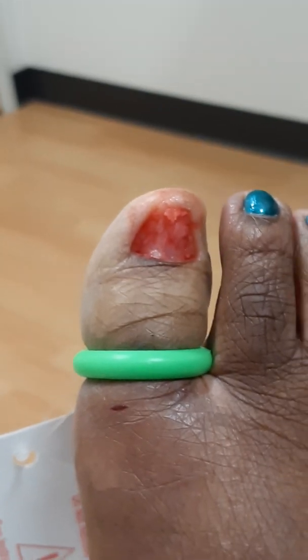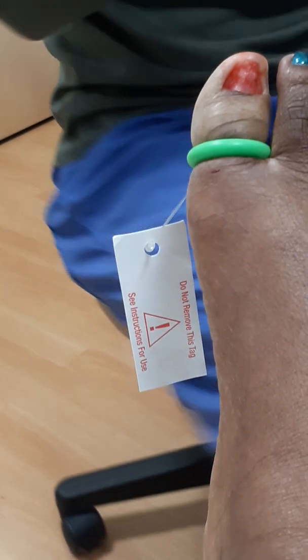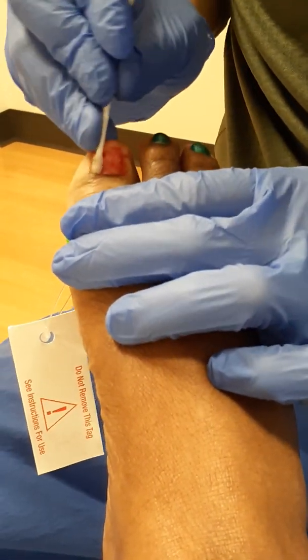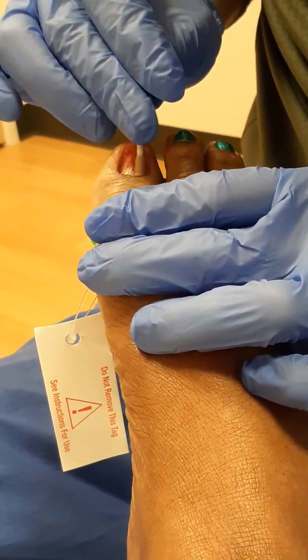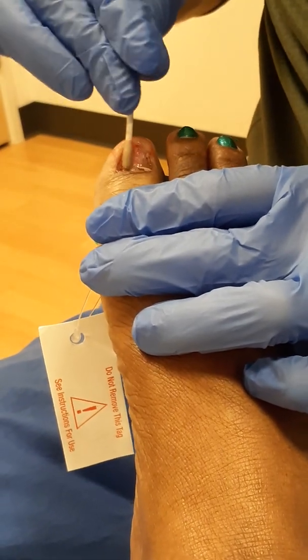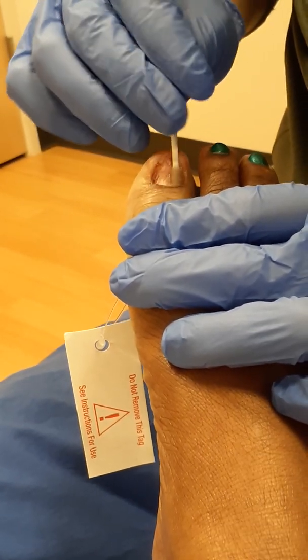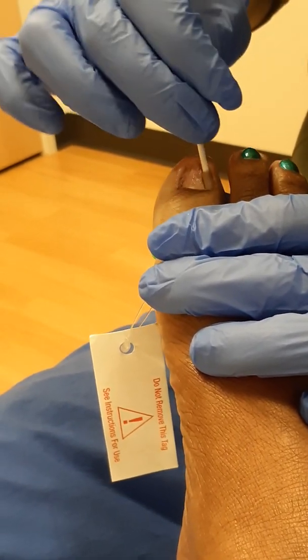I'm going to start with the phenol now. That's the chemical we use to kill everything, okay? So did Dr. Tidwell kind of go over what this does? I guess what he just said, it just kills it, doesn't make it grow back and stuff like that. Right, so it's a chemical, you're basically chemically burning the nail bed, okay? So you're going to notice some kind of drainage and redness to this toe for a little while, because we're essentially burning it, okay? So think about how when you burn yourself on the stove, it turns red, it gets a little bit flaky and kind of scaly. You're going to notice similarities with this, okay? So don't be alarmed by some drainage for a little while.